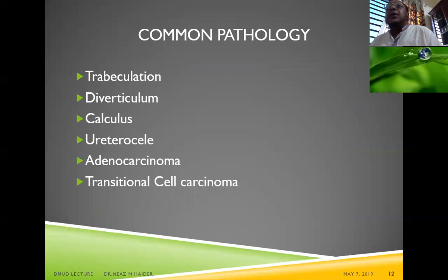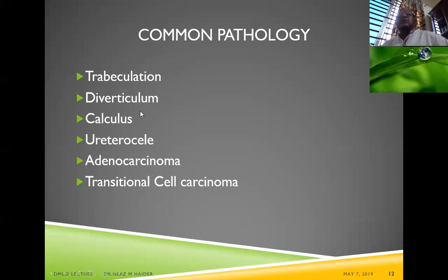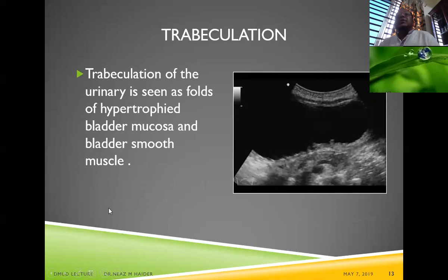We now look at normal and abnormal pathologies of the adult urinary bladder. We can diagnose trabeculation, diverticulum, calculus, ureterocele, and neoplasm. Trabeculation of the urinary bladder is seen as folds of hypertrophied bladder mucosa and smooth muscle — giving a coarse, irregular appearance to the bladder wall.